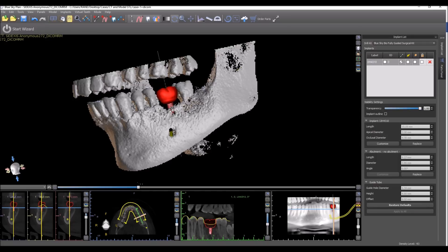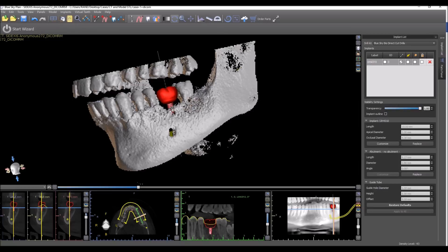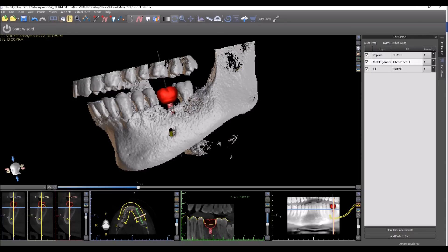Now the same happens, let's switch it back. Let's look at the parts panel. What's being displayed here is the parts for the direct cut drills. Now if we switch and go to the fully guided kit, switch back to the parts panel, then we see that the parts have adjusted and updated accordingly.